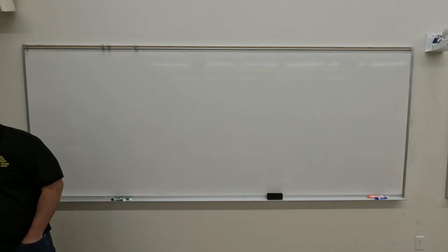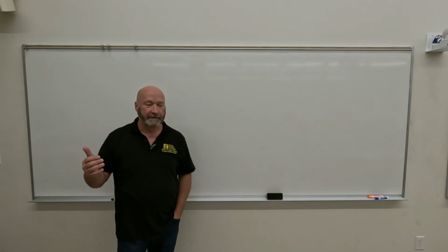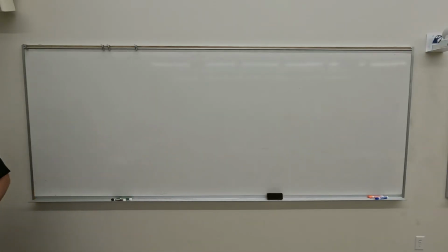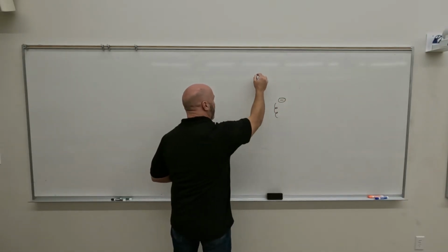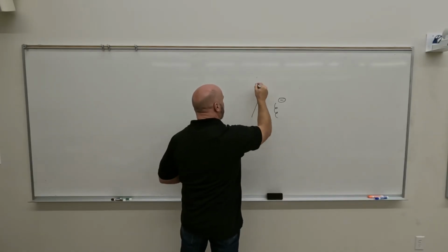rotating anode. So when we refer to the anode, we're referring to the entire positive end of the X-ray tube. So we've got supply of electrons from the filament. So that will be our negative end, and then we've got in comparison, the relatively positive end.